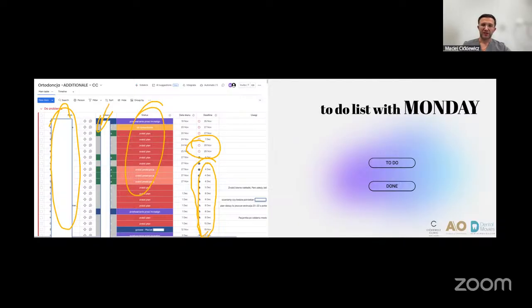So the other doctors also have the options for this plan. So communication is faster here. Then we don't want to slow down our workflow here, because slowing down can happen. Then you cooperate in only one software, and you see only the changes between the planning, like the animation.